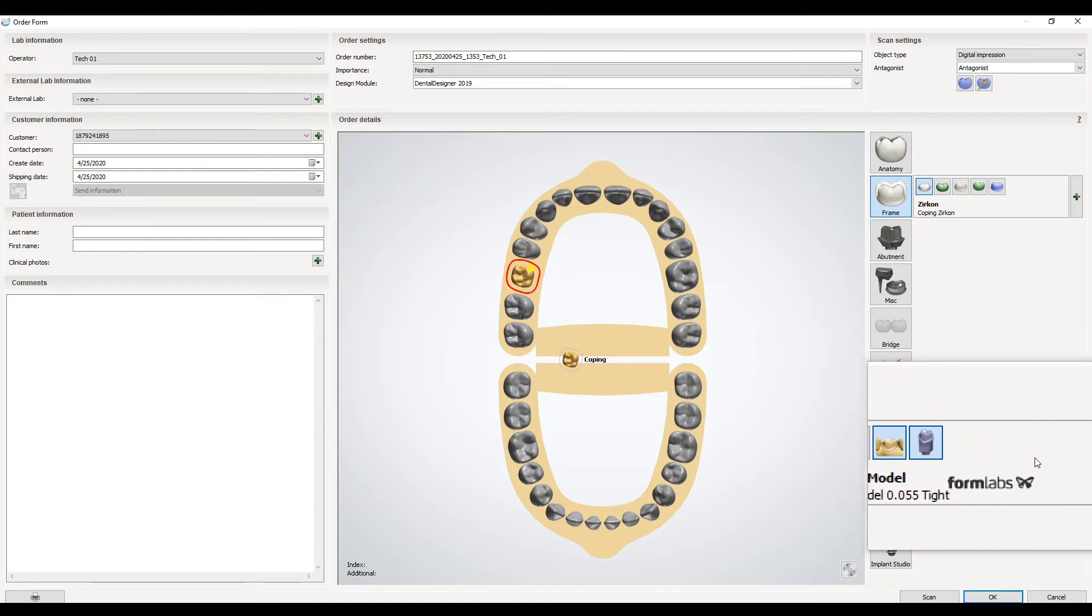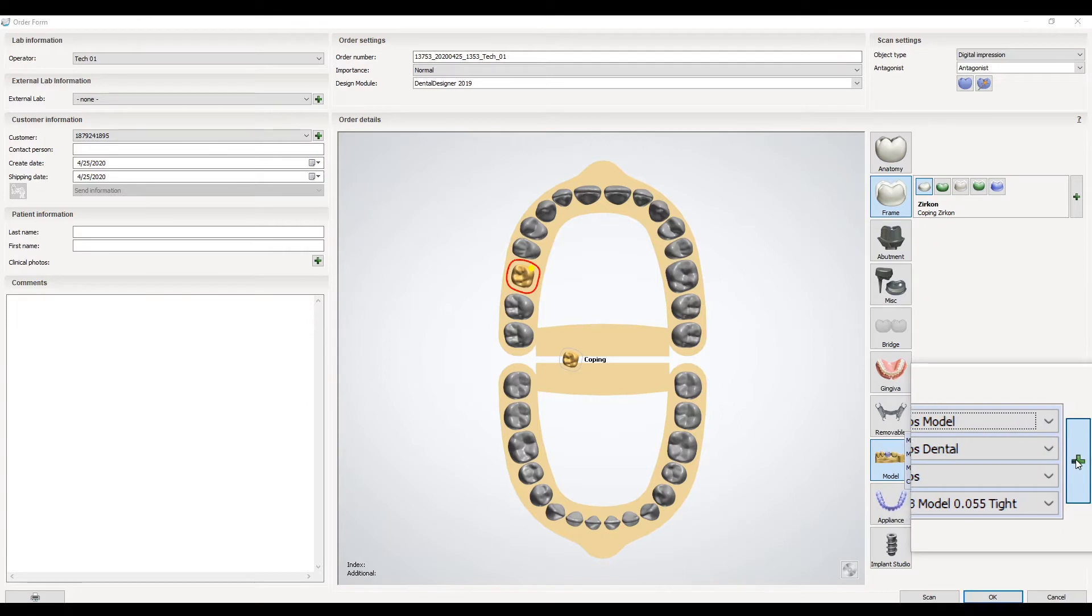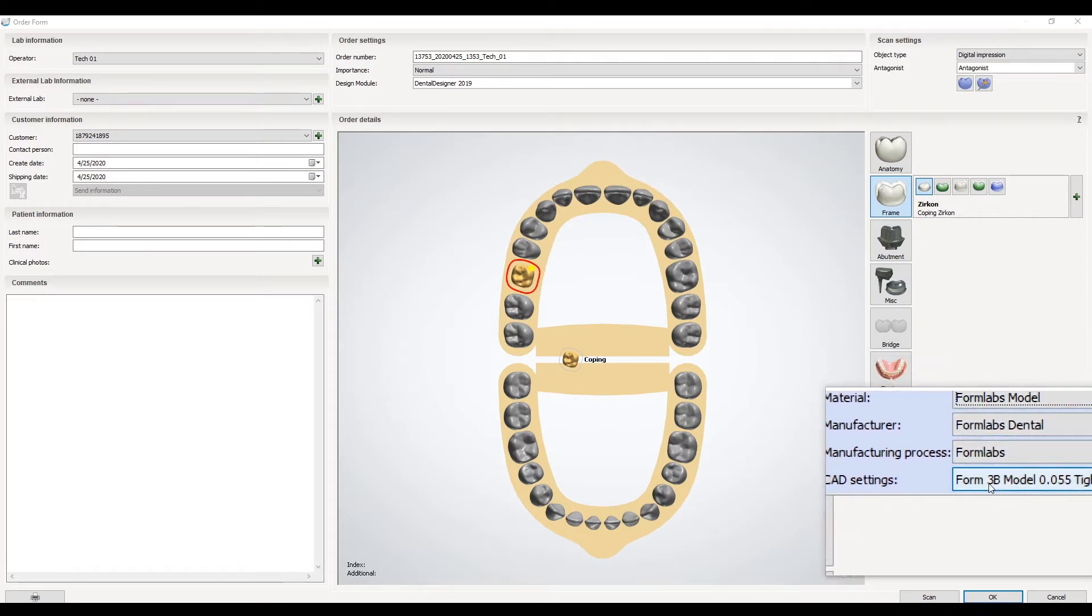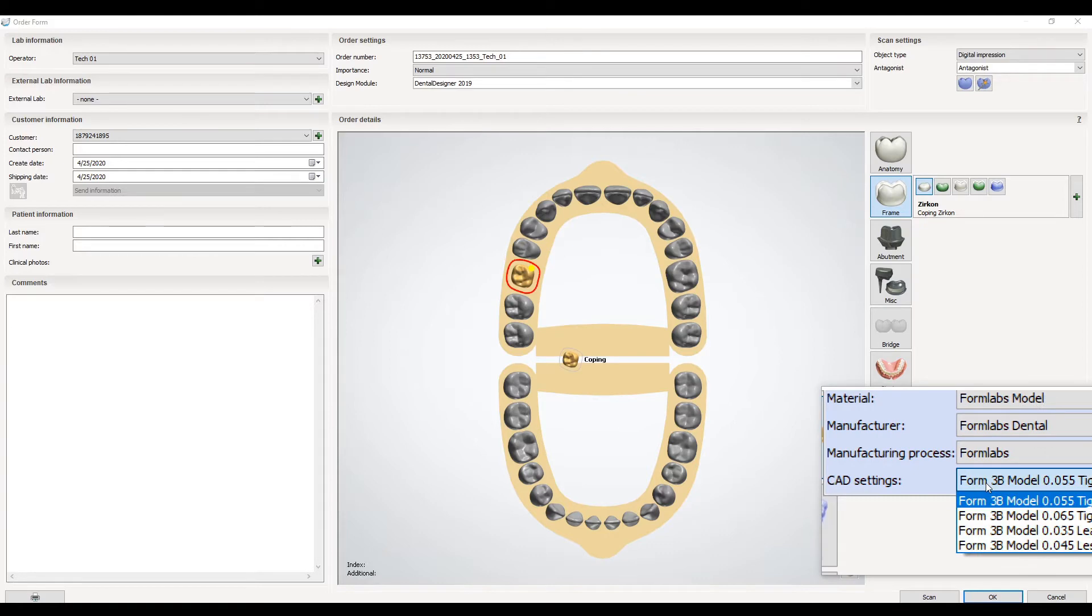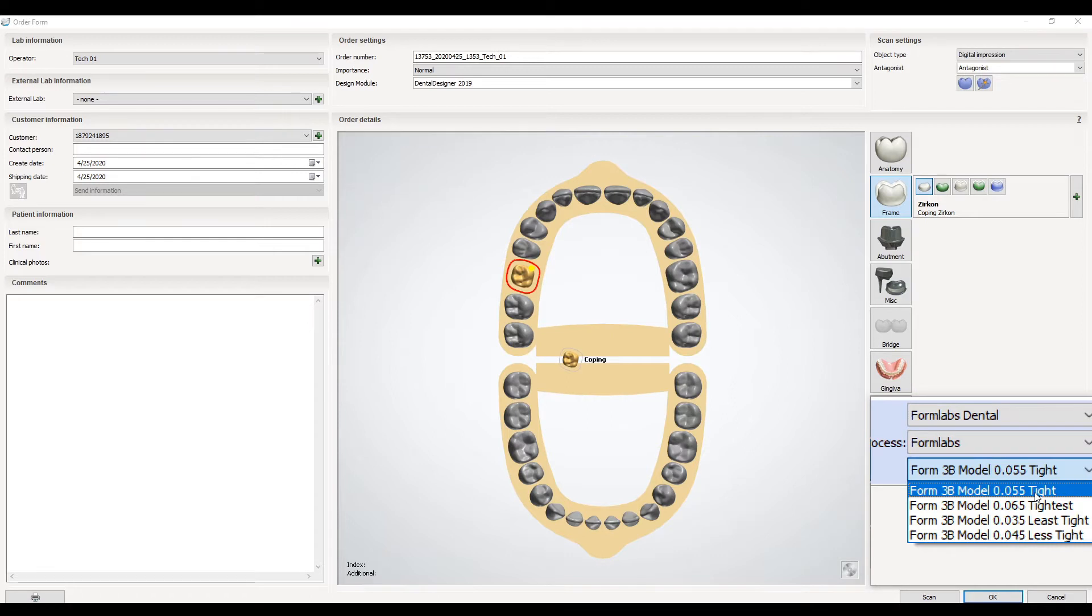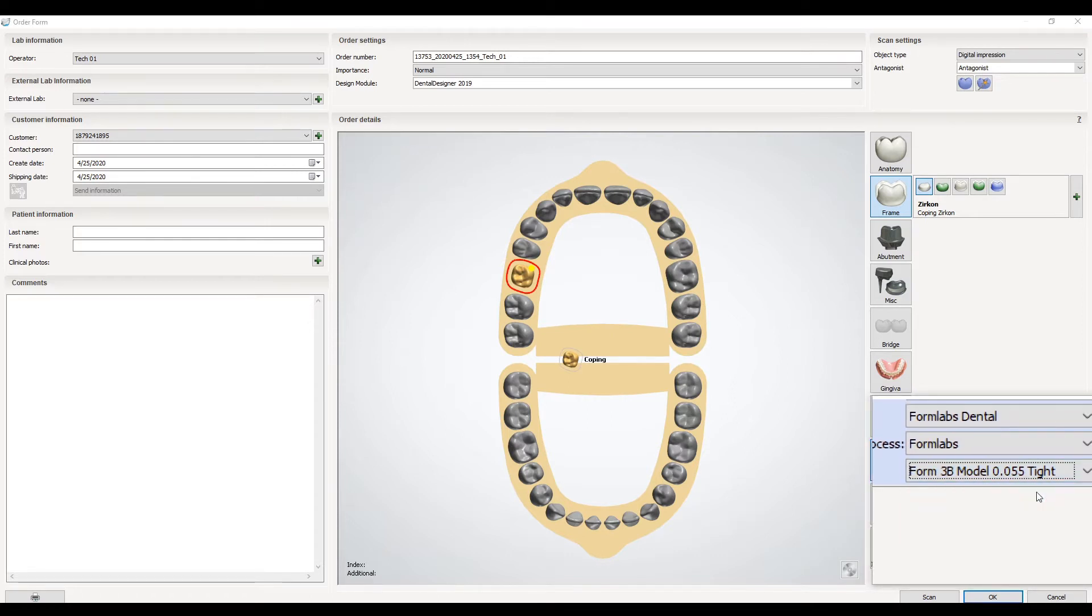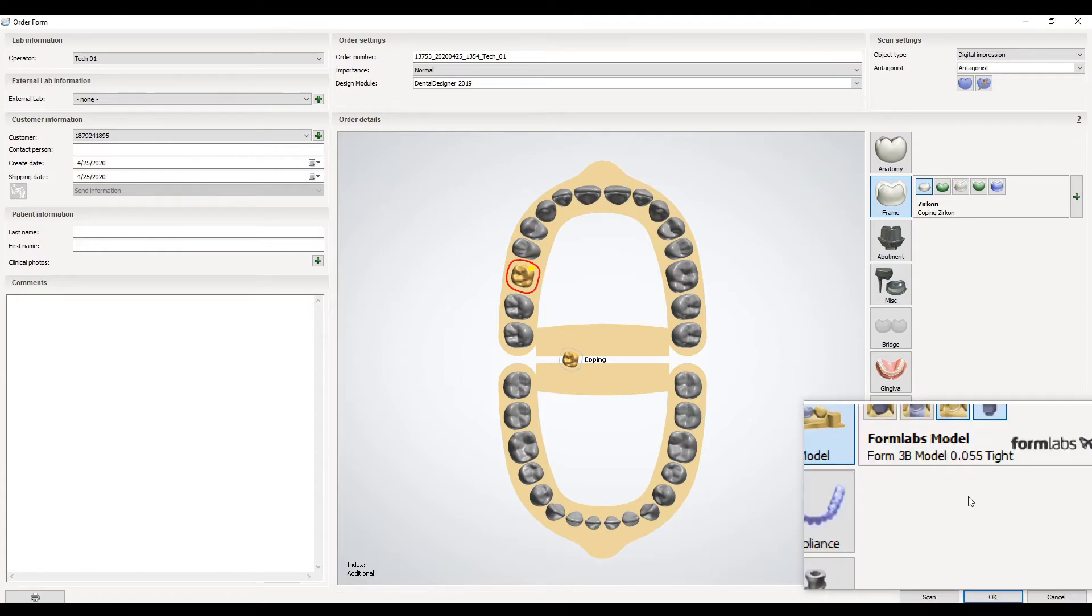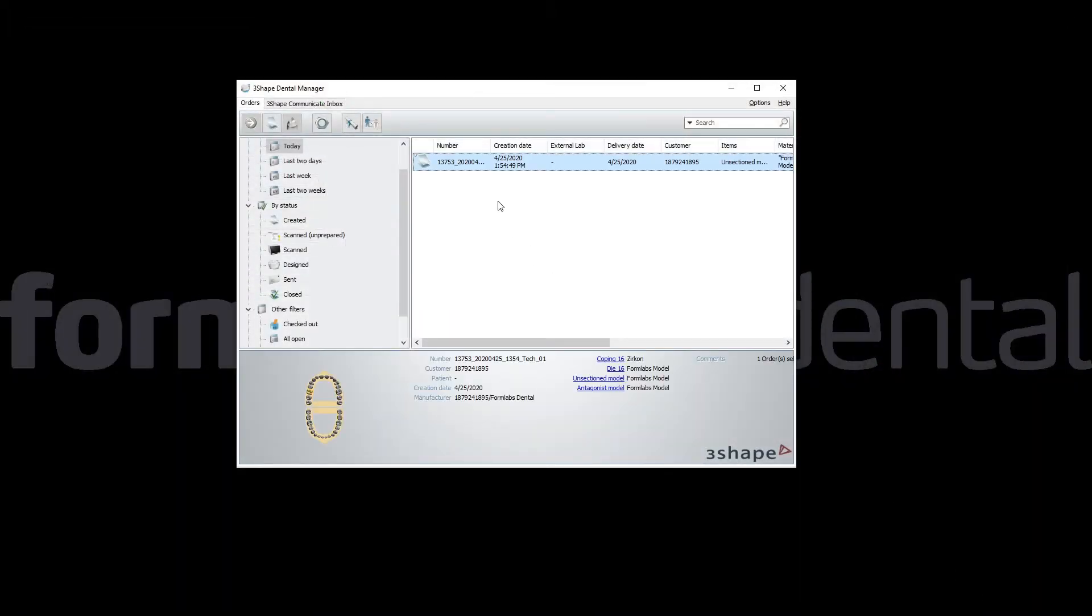You can output both at the same time if you want, but this is how you would make a quick easy-to-use removable die. Hover over the green plus arrow on the right, make sure material Formlabs model is selected, and then in CAD settings the Form 3B model setting that you want. All these different options are really for removable dies. For solid they perform exactly the same, so it doesn't matter what you select here for solid models. Once the order is set up you can save out the case and begin the CAD process.